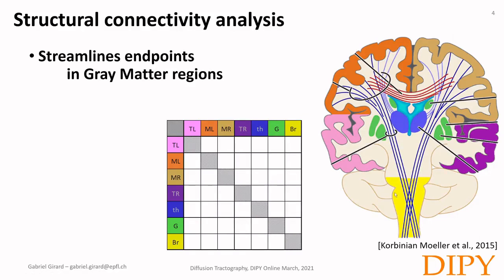We will now use those tractography streamlines to compute this structural connectivity. Most of the red streamlines represent the connection from the motor left in orange to the motor right in brown. We can use those streamlines to compute the values for those two regions — motor left to motor right. And since diffusion MRI is symmetric, this connection is also symmetric, going from motor right to motor left as well, so it has both connections.